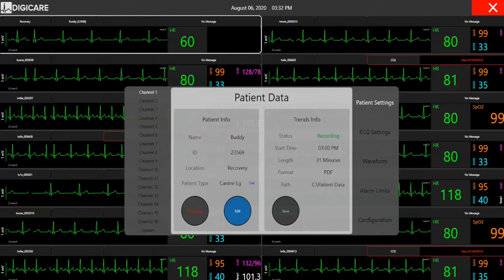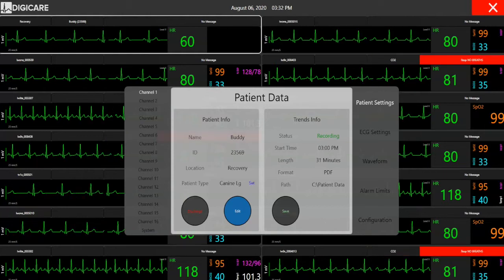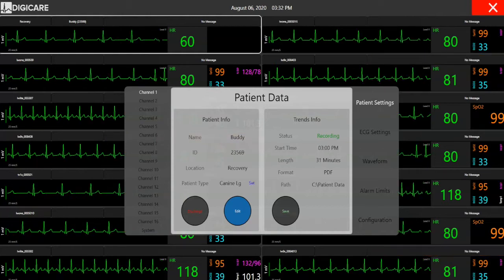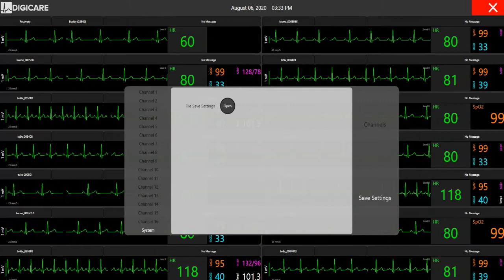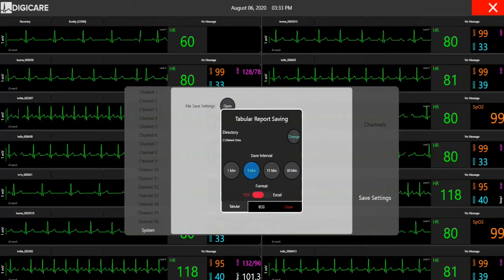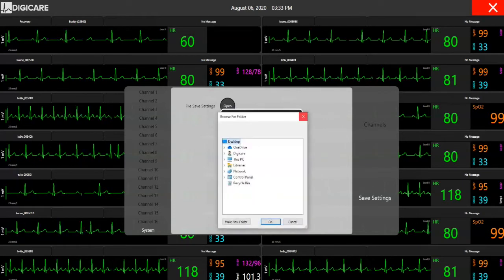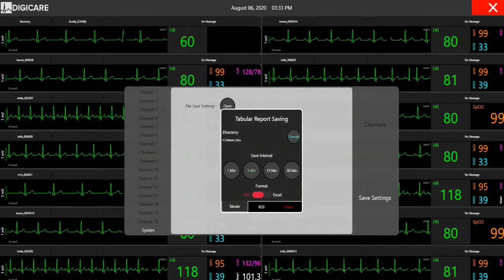The Patient Settings screen shows how long the data has been recording, the format of recorded patient data, and where it will be saved. There are options to save tabular data as a PDF in different time intervals or an Excel report. Users also have the capability of saving directly to a shared folder on their network so they can upload the records into their practice management software.